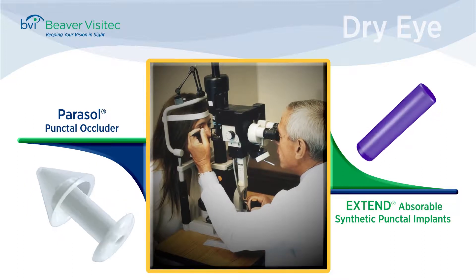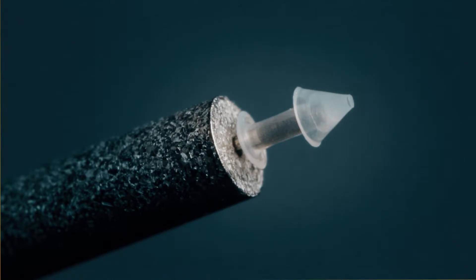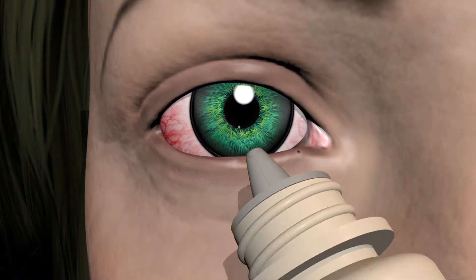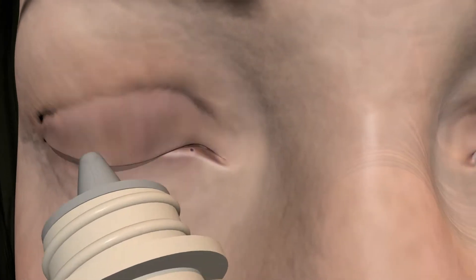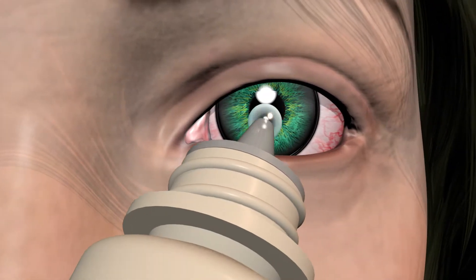The unique patented design of the Parasol plug provides for quick and easy insertion. Though punctal occlusion is painless, it helps to first place a single drop of topical anesthetic to the cul-de-sac of each eye to control the blink reflex.